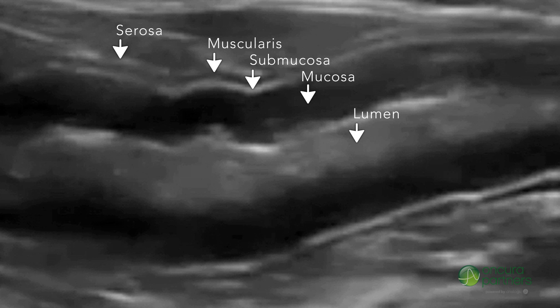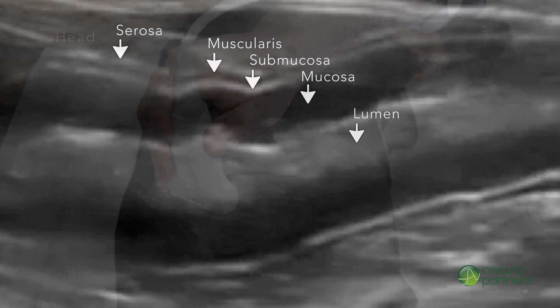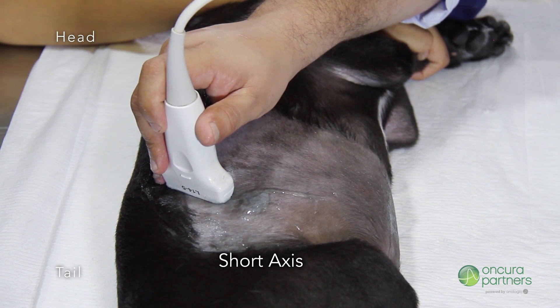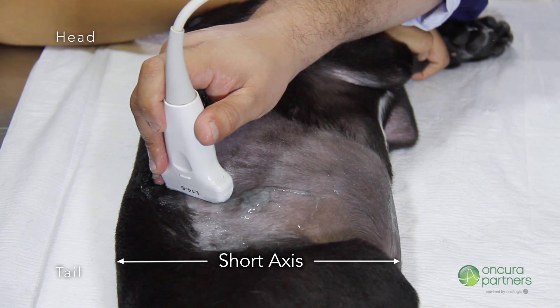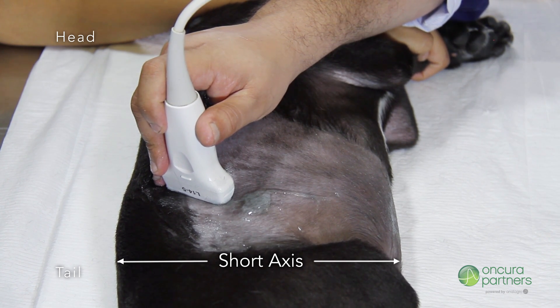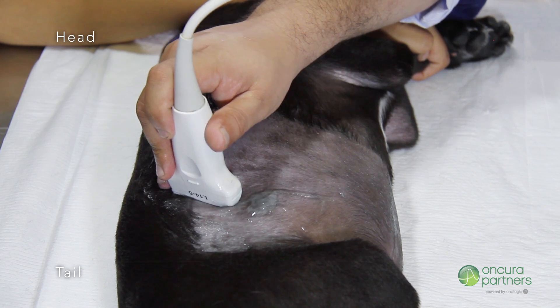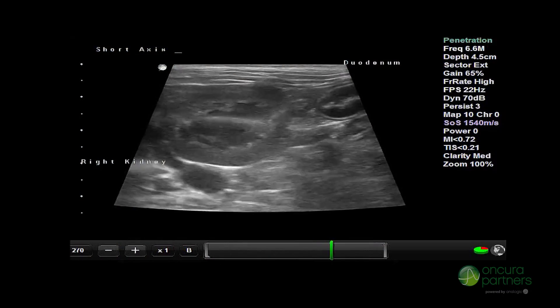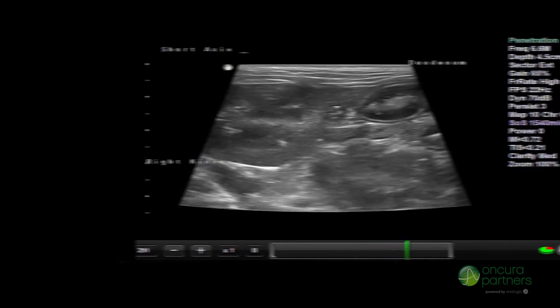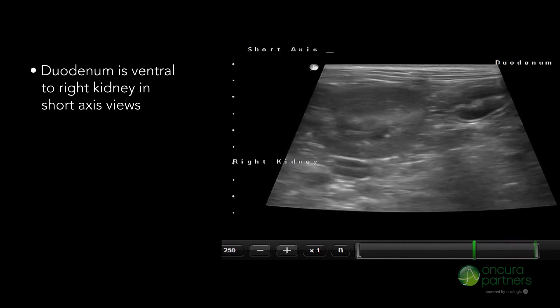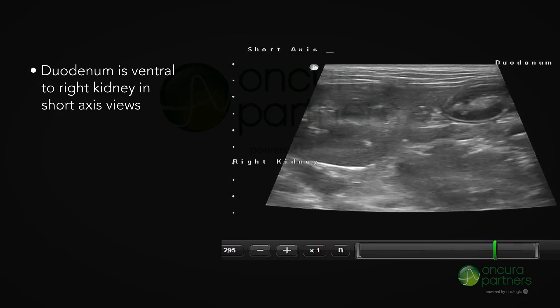If visualization in the long axis is proving difficult, use color Doppler in the transverse plane. Repeat the evaluation in the short axis plane, ensuring that the marker points dorsally towards the spine. Use an adequate depth to cover the anatomic landmarks; the duodenum will be ventral to the right kidney in short axis views.